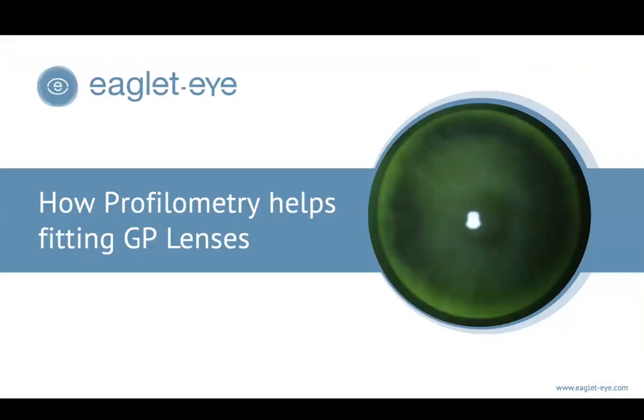Now, finally, we have GP fits, and this is one of the things I'm most excited about in the clinic lately with our profilometers, just because it's so cool to see our software really developing, again very similar to how we've seen sclerals progress. We have never forgotten about the corneal GP.